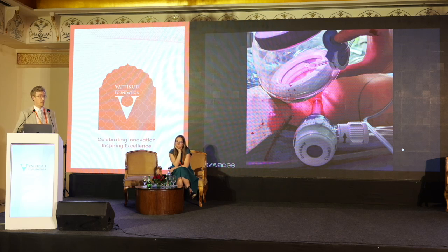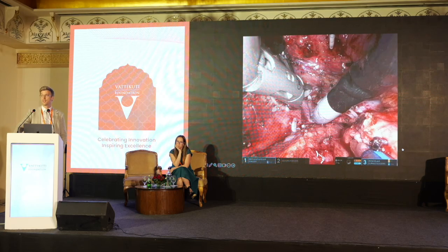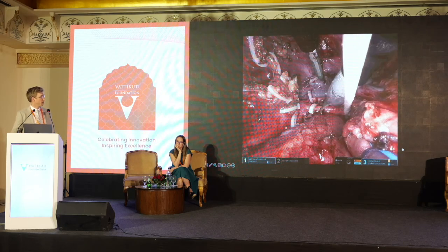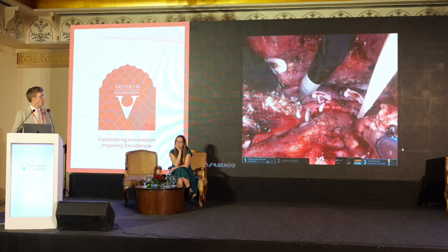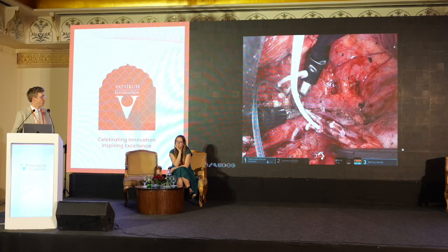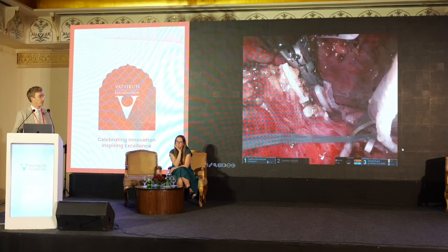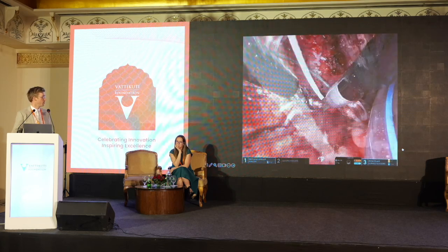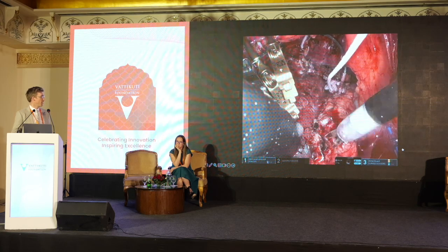We placed an extra AirSeal trocar so that the bedside assistant can clip very easily. And then you see here the clipping as preparation for the intracorporeal cooling. So we do a small venotomy as well as arteriotomy, and then we flush the kidney with saline at 4 degrees until the effluent of the vein, as you see here, is transparent and clear, which means that there should be no remaining clots inside.